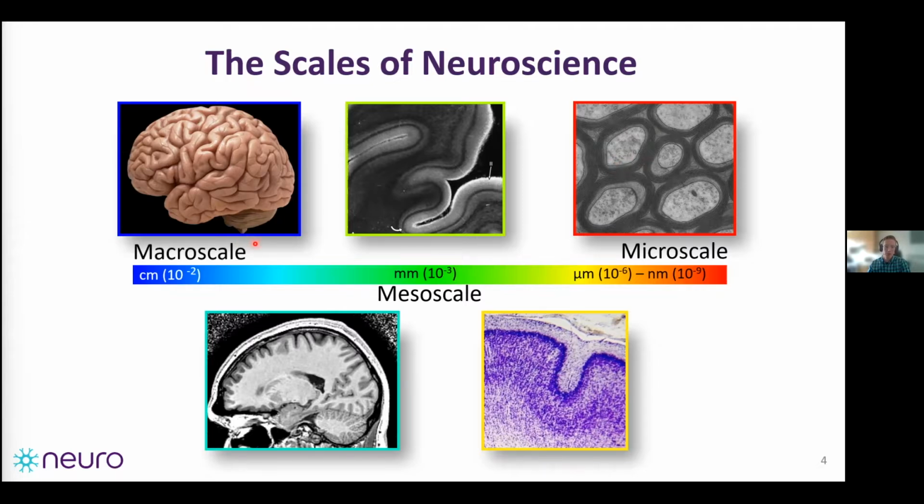So MRI is realistically limited by physical constraints, especially for in vivo work. We're sort of limited to millimeters, and with higher field strengths, micrometers. But we can use biophysical modeling to attempt to extract some information that exists at the subvoxel level.